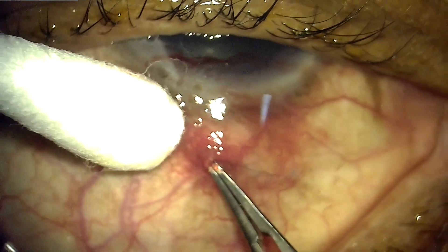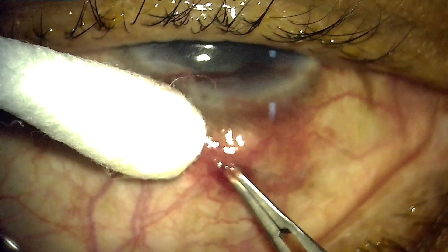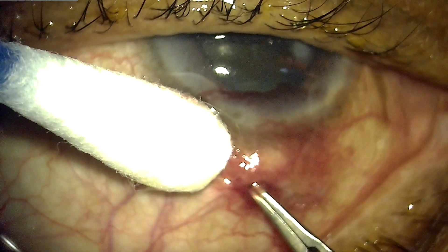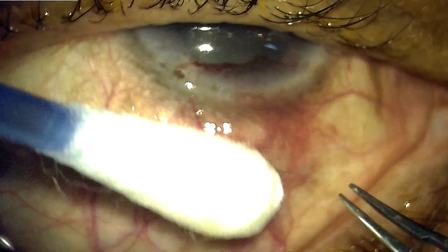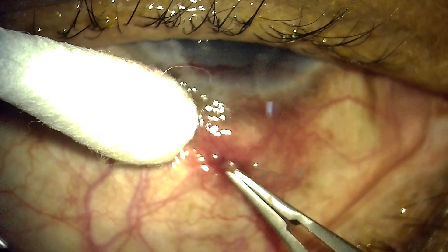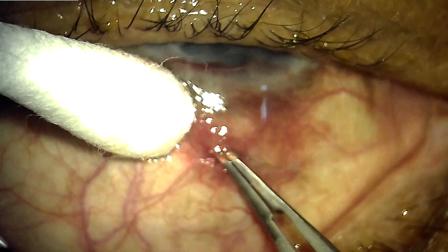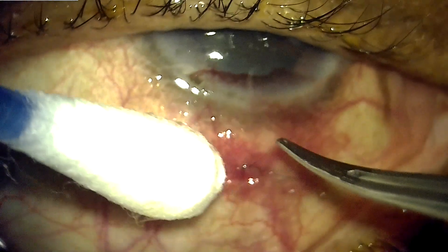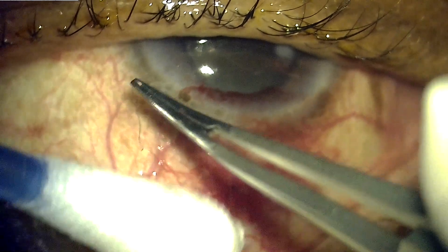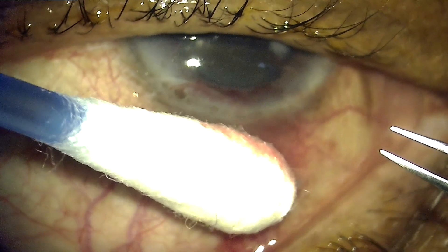In this case we will see how a one-week-old trabeculectomy suture was removed. This has been done without opening the conjunctival sutures, and though it is apparently a blind procedure, we can actually visualize the suture which is seen through the translucent conjunctiva. Here you can see the suture has been pulled out.